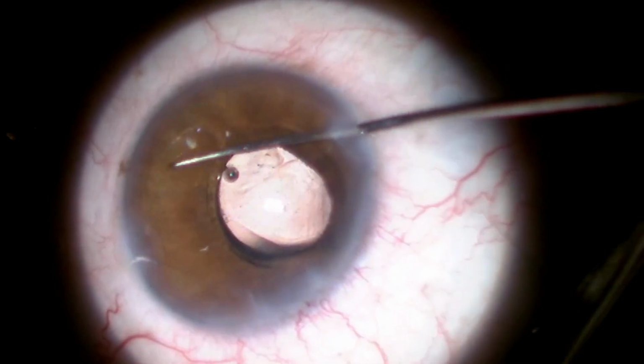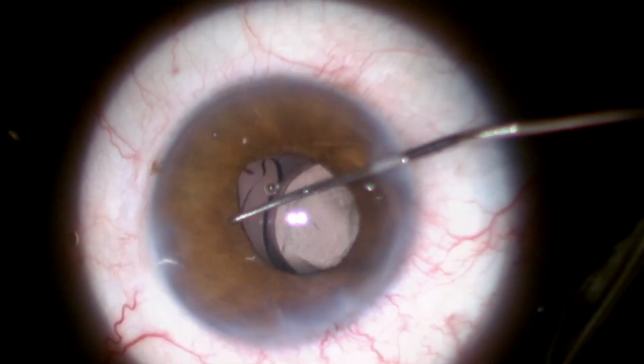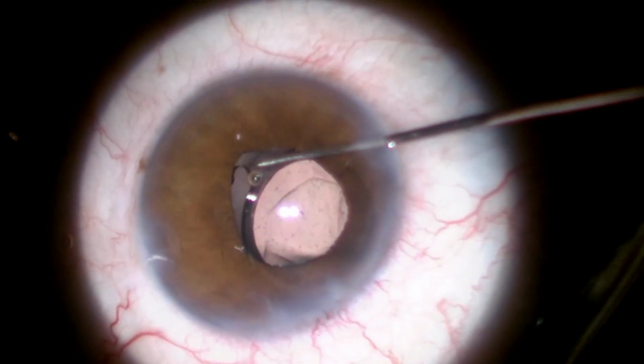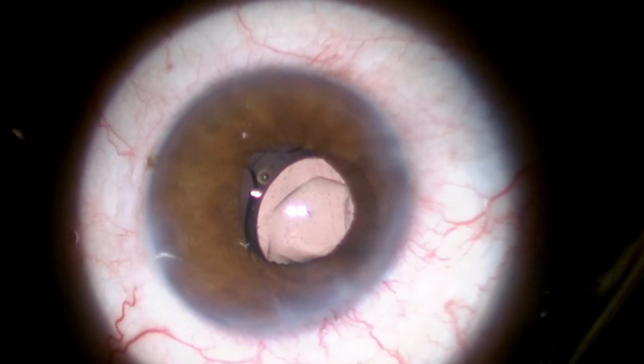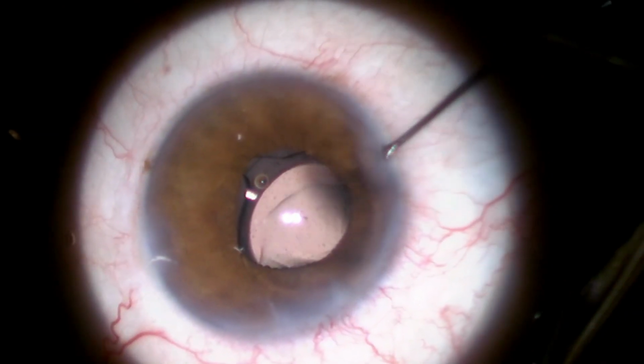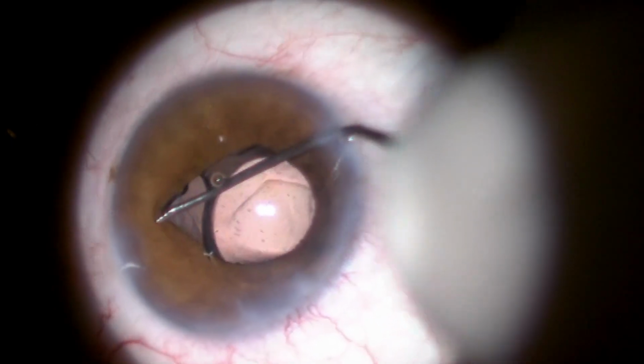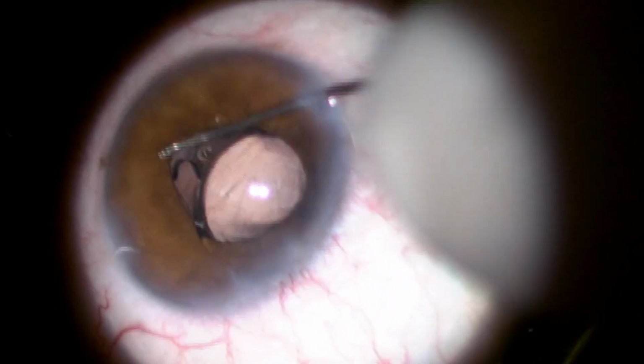This haptic is gently placed behind the iris, and with the help of the Y I am making sure that it is at the right place.